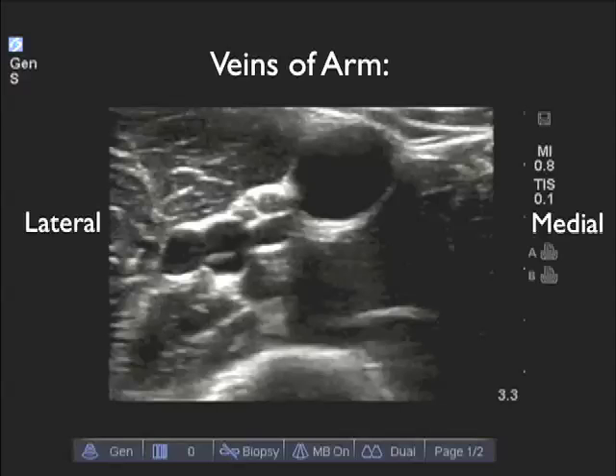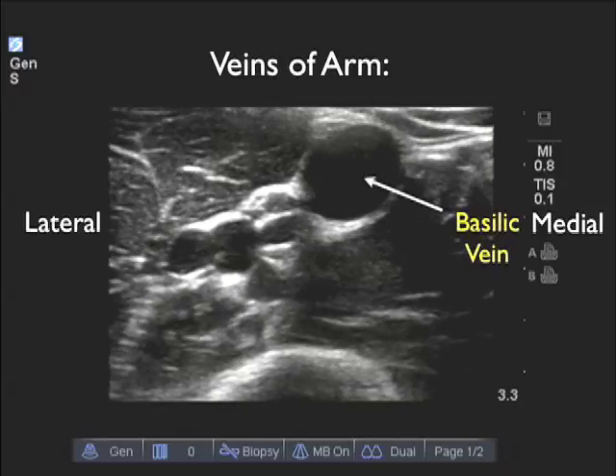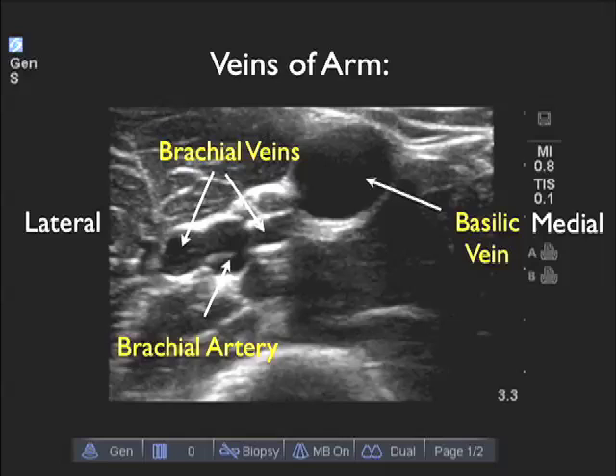Now let's look at a video clip that shows all of the veins of the upper arm in relation to one another — medial is to the right and lateral is to the left. Here we see the larger and more superficial basilic vein, more medial and superficial to the brachial complex. Note the central brachial artery and two flanking deep brachial veins. In this patient, the basilic vein would be the preferred target for placement of a deep arm IV.